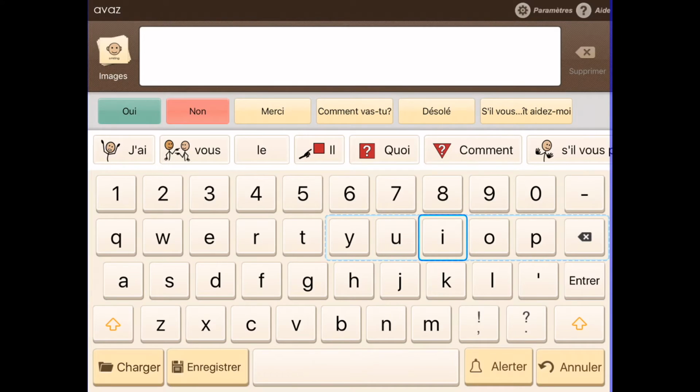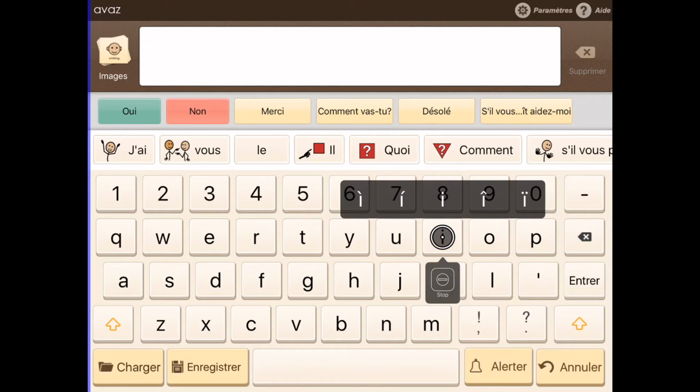Now what I'm going to do is try to get to this eye here and then select it, and you can see that once again if I hit the left switch essentially I can tap and hold, and now all of a sudden we've got all these nice beautiful diacritics there. So what I'm going to do is start scanning again. But see how now it's saying out in the upper right point mode? That's what I want to select.